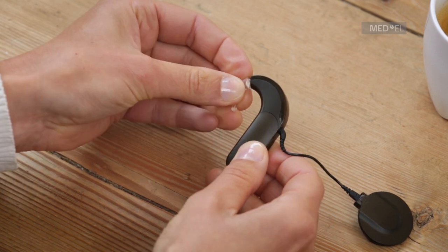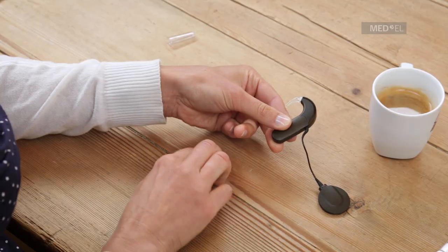Reattach the ear hook and use the ear hook pin to lock the ear hook in place.